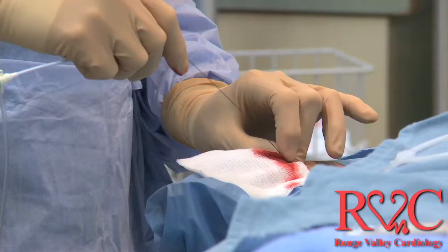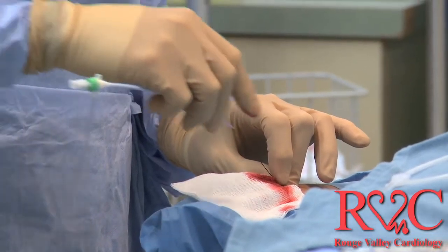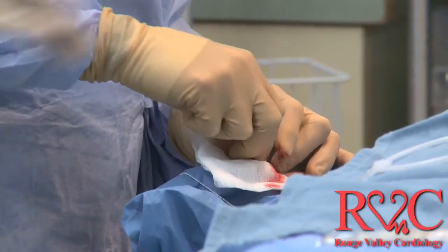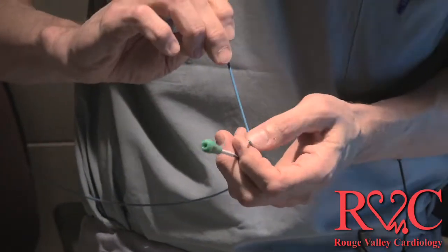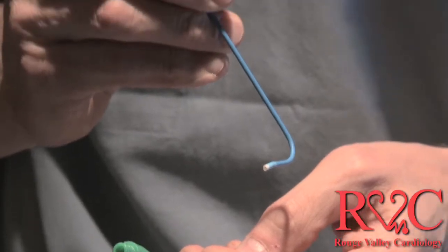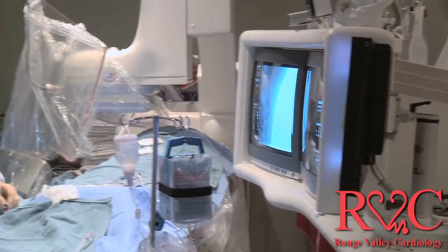Now, in both of these cases, we put tubes into the body through the vascular system, either through the wrist or through the femoral arteries, which are big arteries that we can use. Then we use tubes such as this to inject radio-opaque dye. This is dye that isn't colored, but the X-ray can't see through it, so it shows up on the X-ray picture, and we get a moving picture of what the coronary arteries look like.